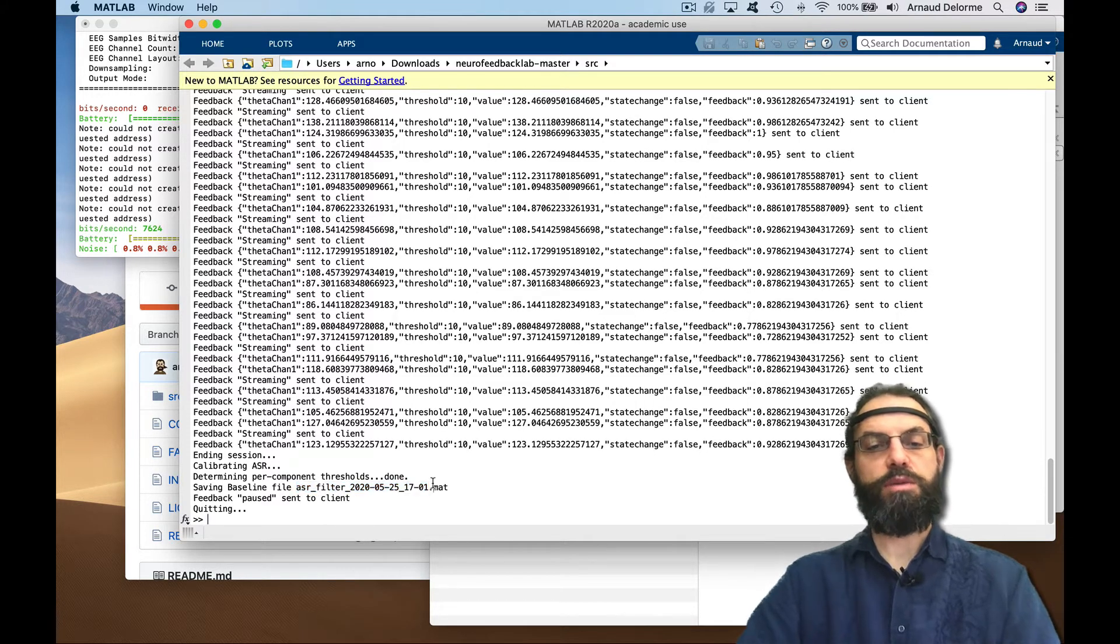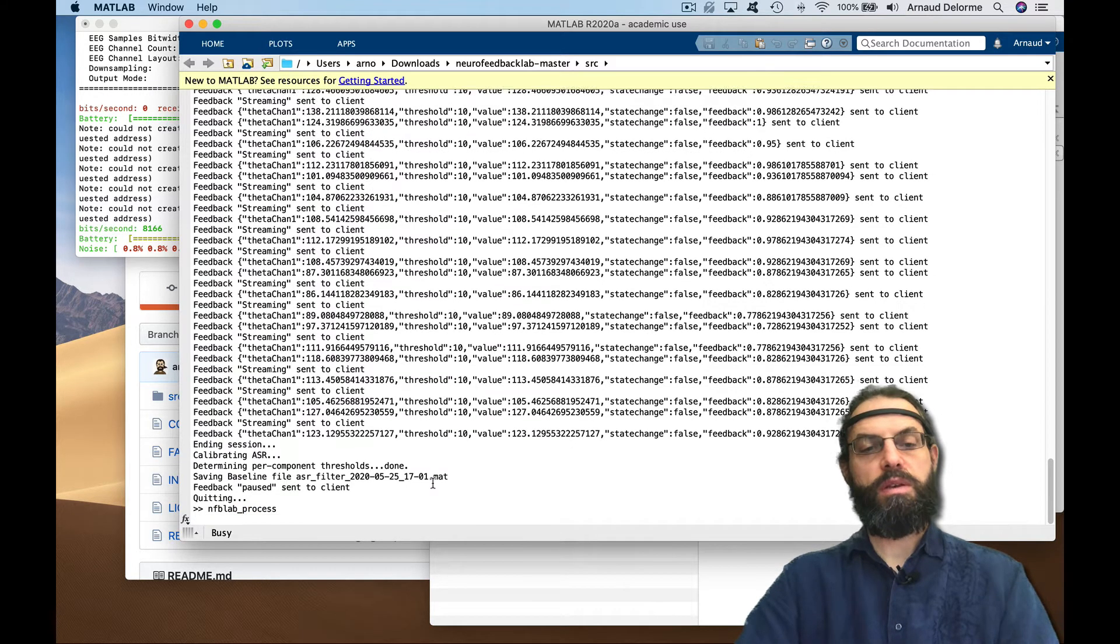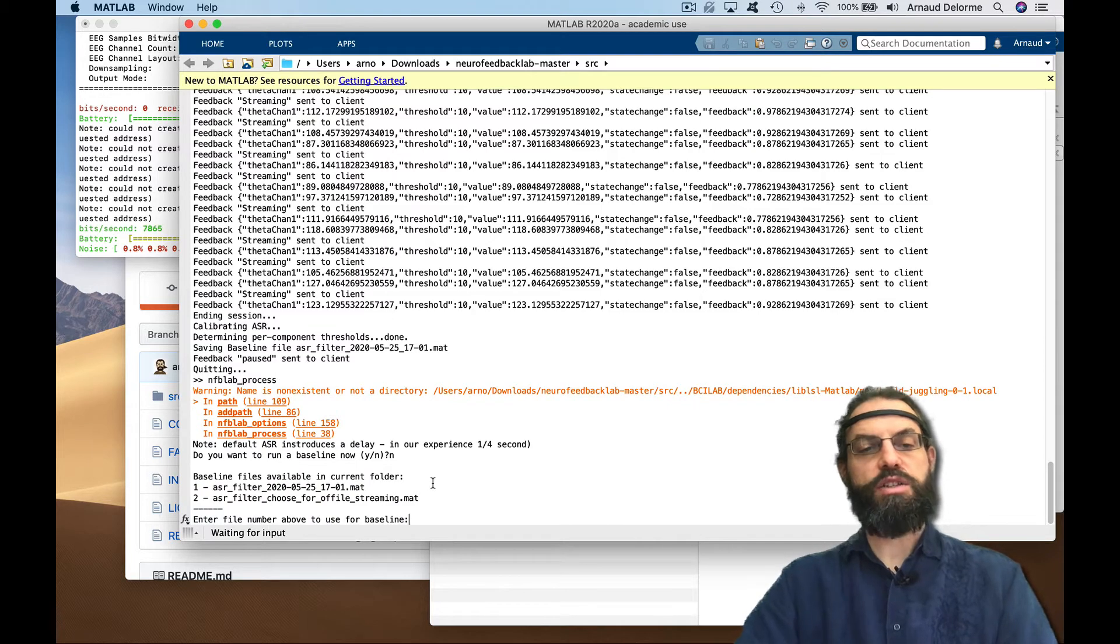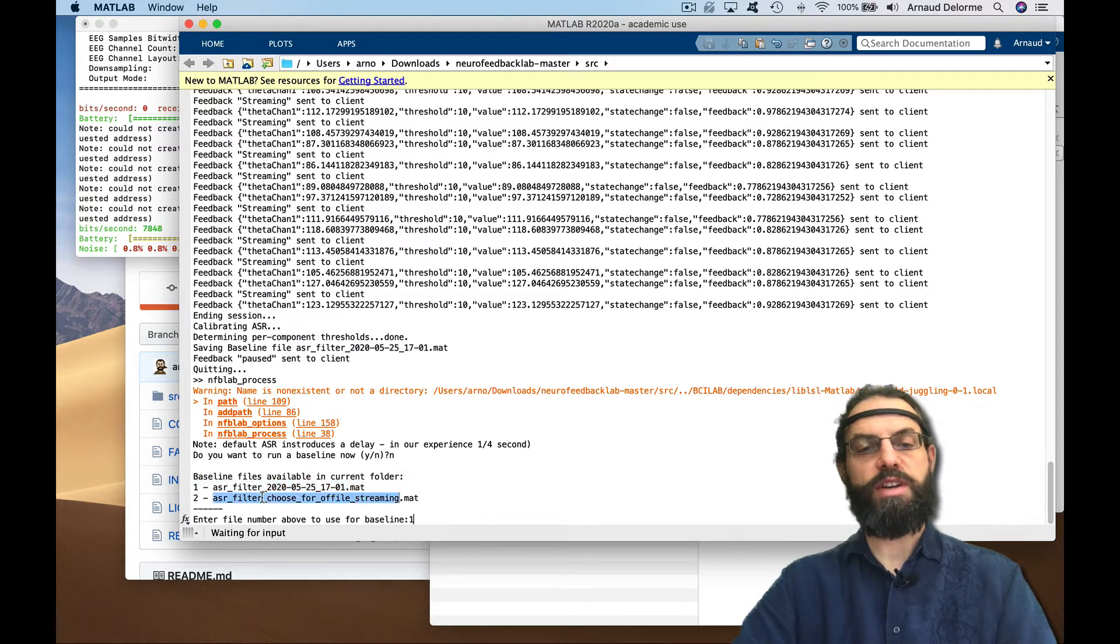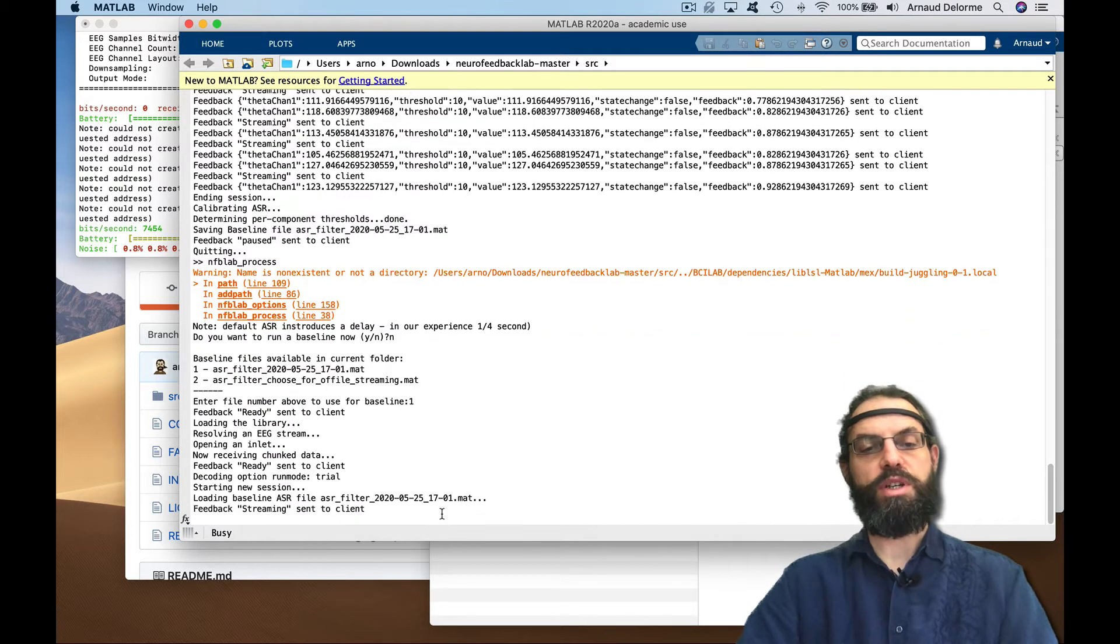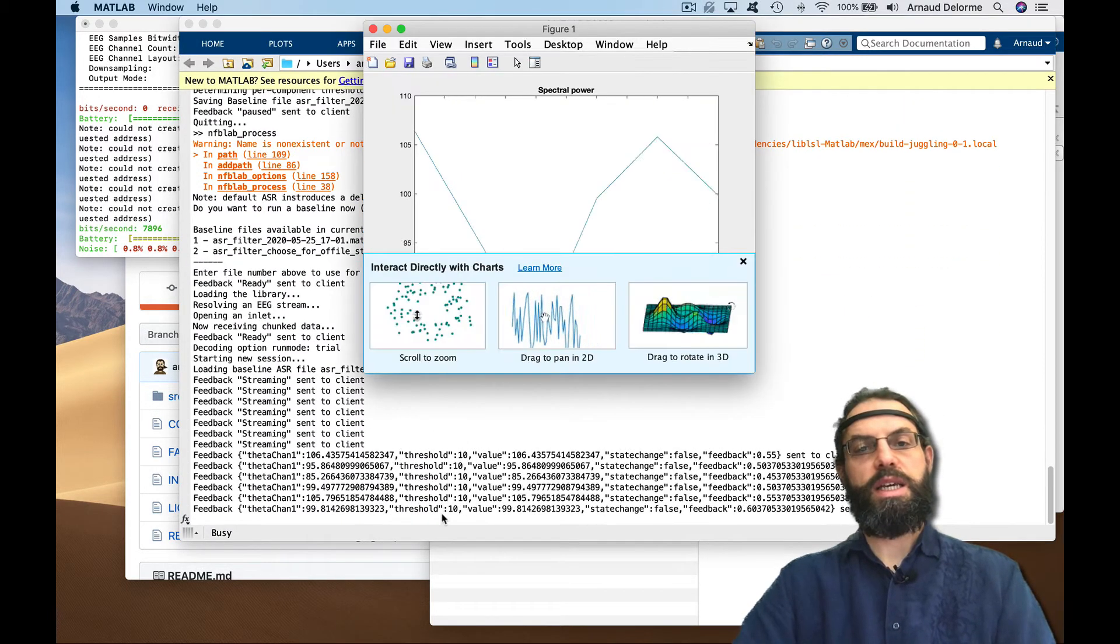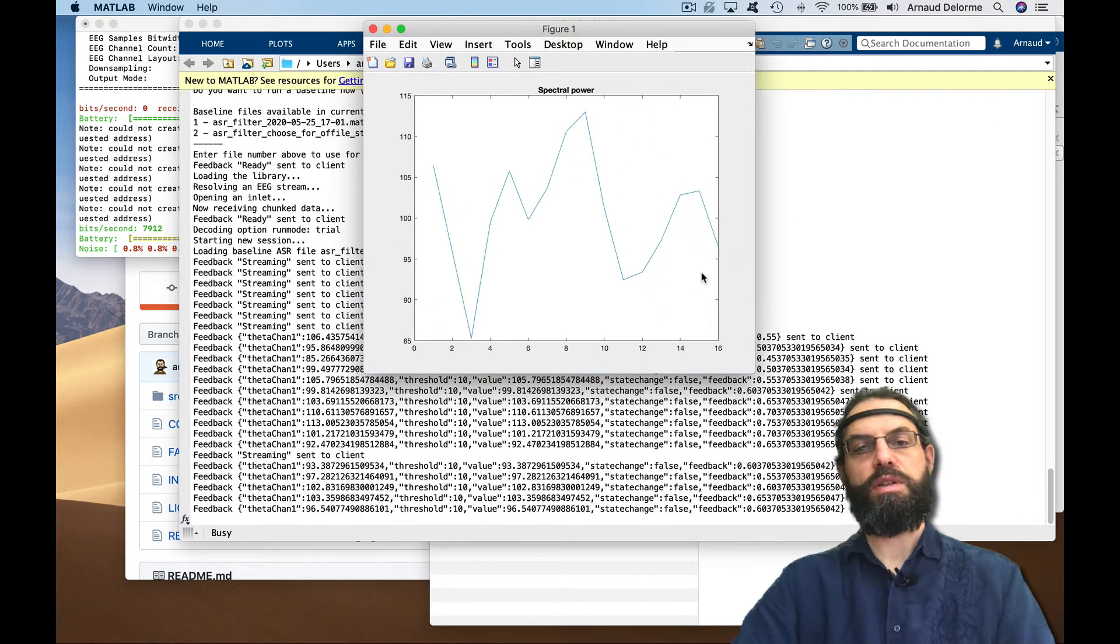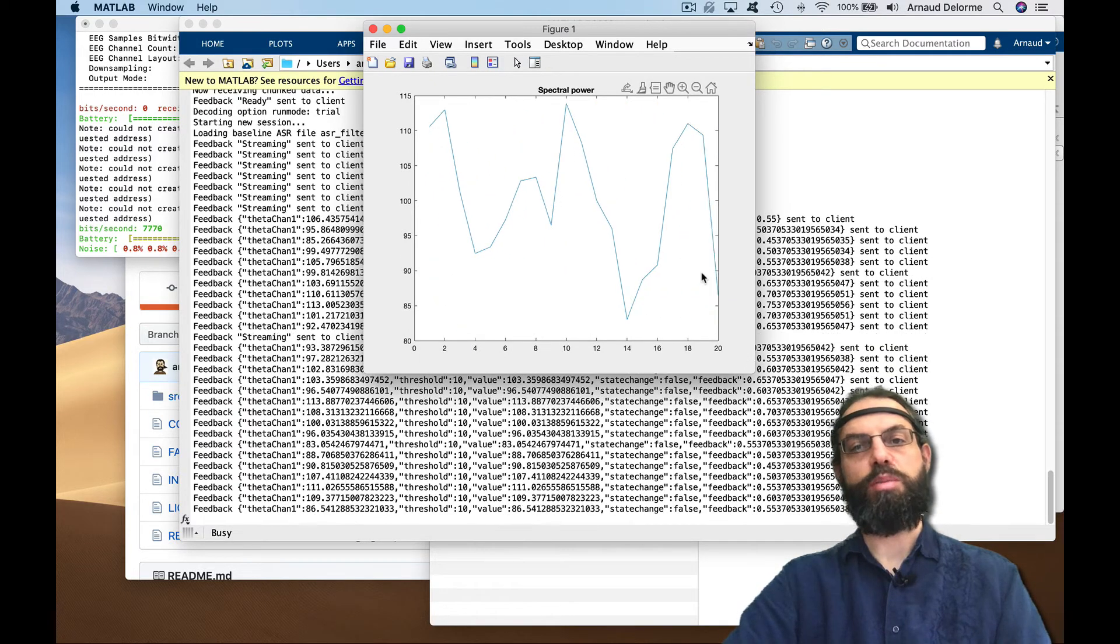It saved the data file. Now we're going to run a real session, so neurofeedback lab process. Do you want a baseline? No. Which file do you want to use for baseline? It's going to list the files. There's one for offline streaming and the one that just recorded right now using the date and time. I'm going to press 1 and now it's streaming to clients.